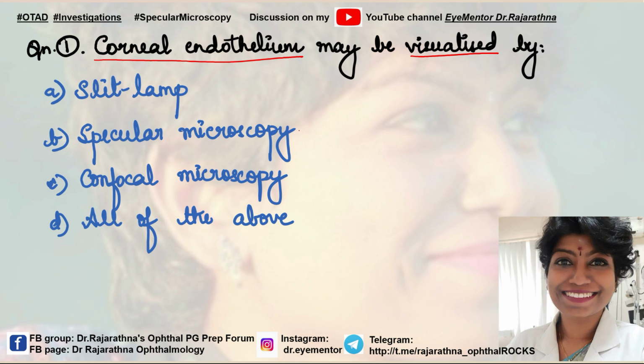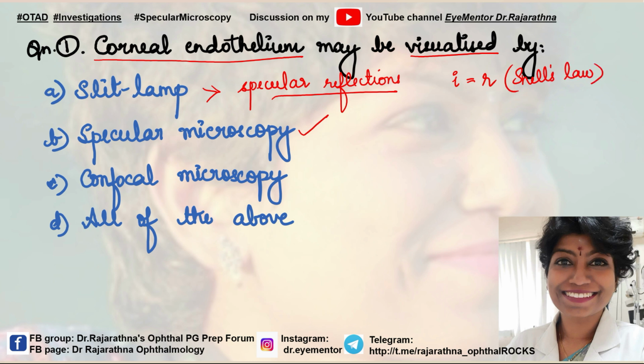Now, all of you know that specular microscopy is definitely used to visualize corneal endothelium. What you probably do not know is that you can see the endothelium even on slit lamp if you adjust the viewing settings in such a way that you can see the specular reflections. So you adjust the observation arm and the light in such a way that the angle of incidence is equal to the angle of reflection, right? So in slit lamp we use this Snell's law. You know, right? So we make use of this principle, and we can see the endothelium.